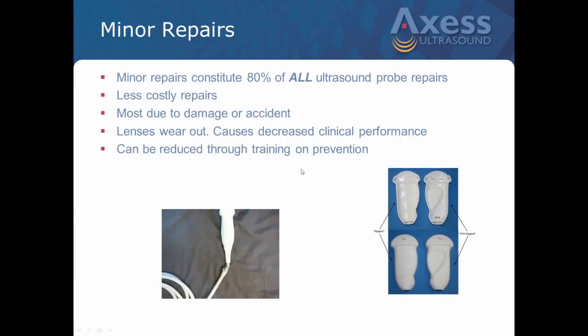Oh, okay, we have a question from Chandra. Can one get replacement plastic outer casings cut open for repairs? Not sure I understand that. Oh, well, if you're talking about the outer housings here, depending on the model, we have several of those. So yeah, we can sell you the housing. It's a little difficult to get those apart, but we could probably talk to you about that, maybe offline. I'd like to get a better idea of what you're asking for.